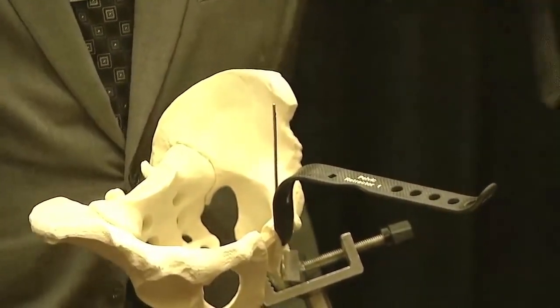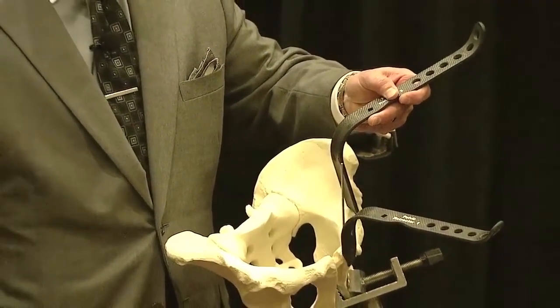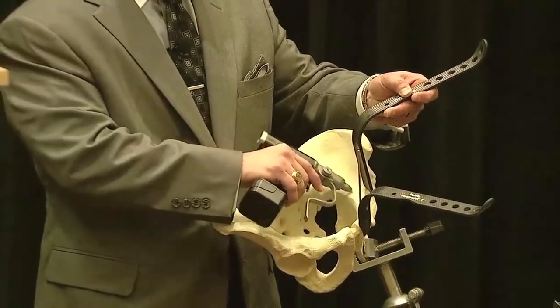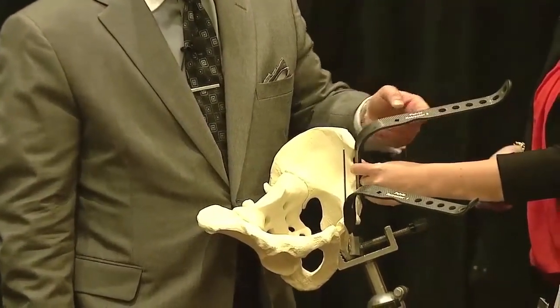Number two does not have a pin because this one goes up over the lip of the acetabulum. It helps reflect the musculature and the vessels so we can see the dome of the acetabulum. All right, I can't pin that one in, but Claude will show you where it goes, and Karen will give us a hand by holding it.